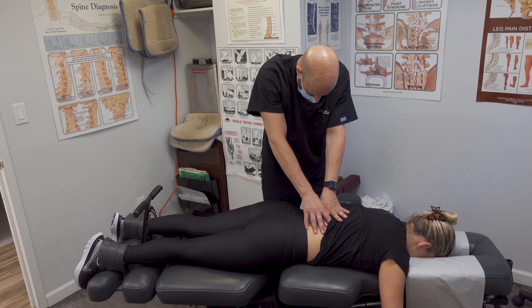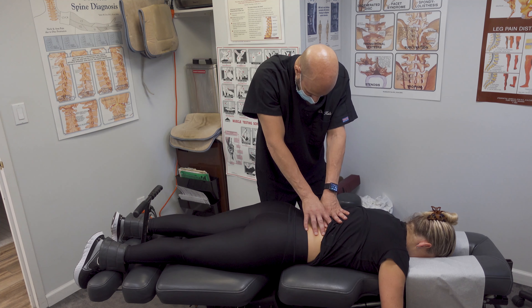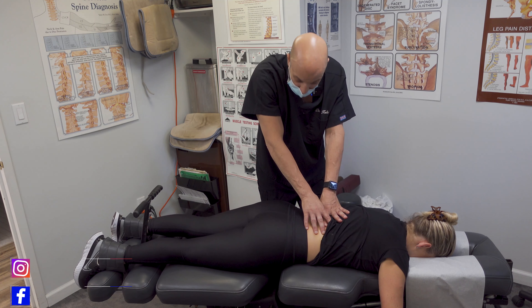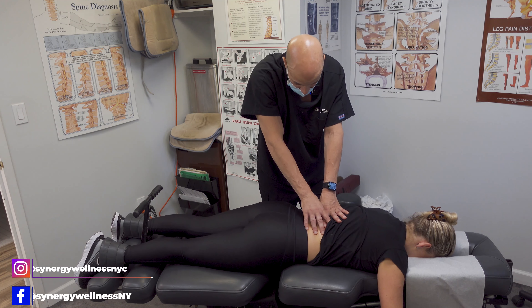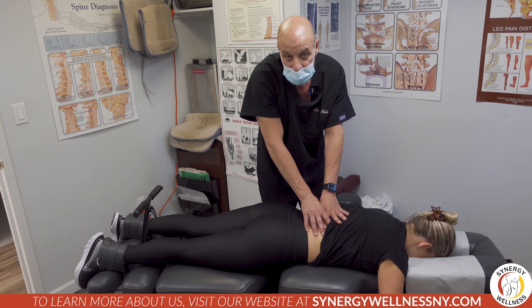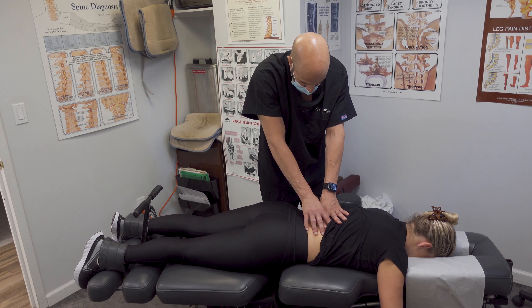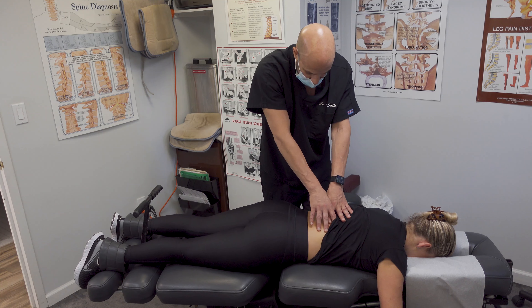Deep breaths in and out. Research shows that when we sit down we're putting about 220 pounds of pressure on our discs, and when we're standing that's about 75 pounds less pressure on the back. Sitting can be very detrimental for people with disc herniations, disc bulges, sciatica, or disc degeneration — also called disc desiccation — when you lose the fluid in the discs and the disc height becomes much smaller.